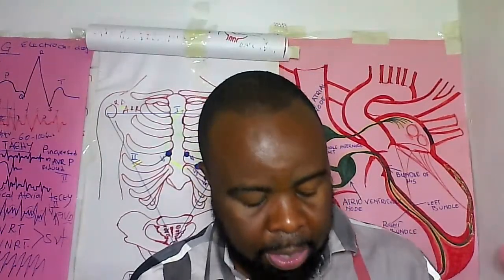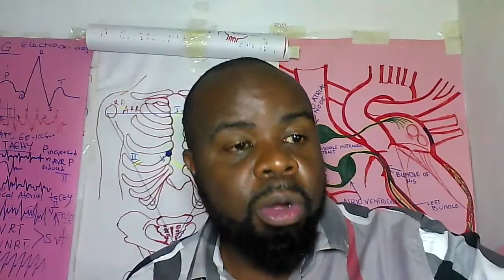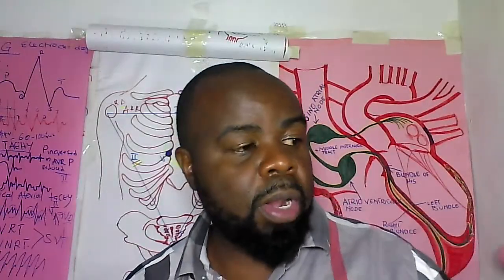How do you know this is a regular rhythm or irregular rhythm? That one I've explained. It's very important. Don't start looking at uncommon things when you get the 6-second strip of an EKG. Start with the normal things. Is the rhythm regular? Yes, it's regular.